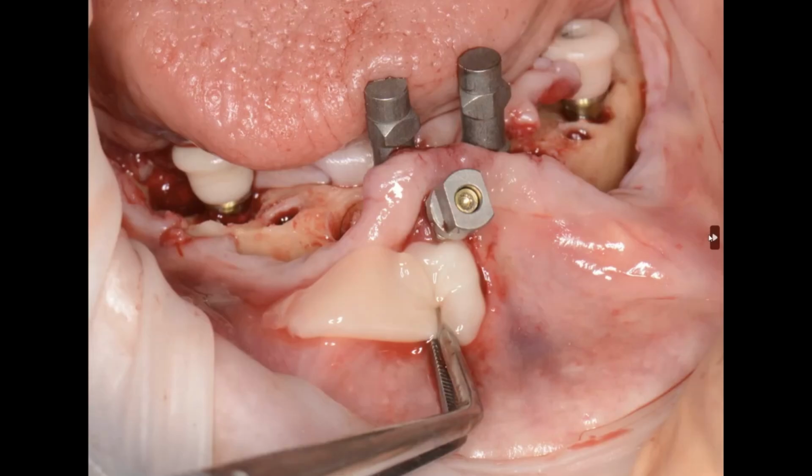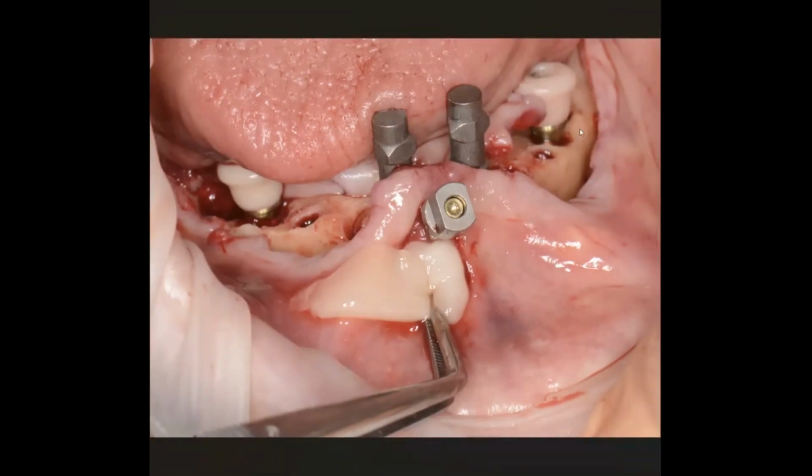So this is as we're getting ready for our intraoral scan. We lift the tissue over the bone screw. We place the scan body on the bone screw there itself. And then in the back on implants and MUAs number 20 and 29, I just place a permucosal healing collar. This is just going to sit there for about 2 or 3 hours while we print teeth. Then I'm going to place 2 catalog scan bodies on 23 and 26, right? 23 and 26. And then we're going to get ready to close.